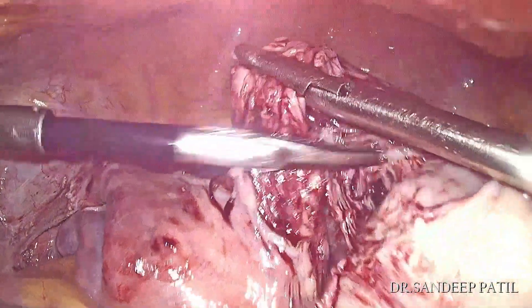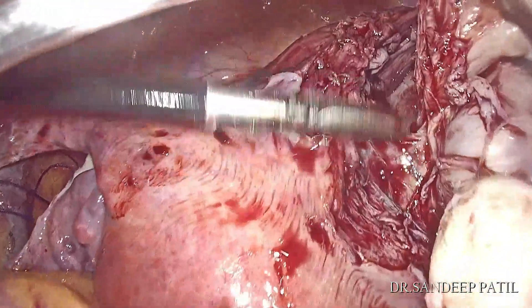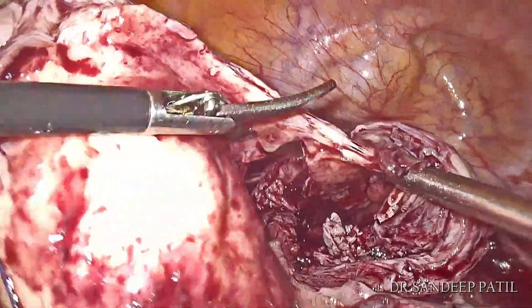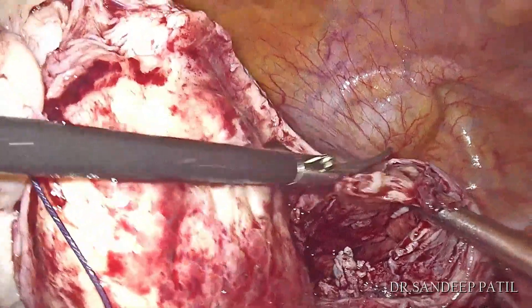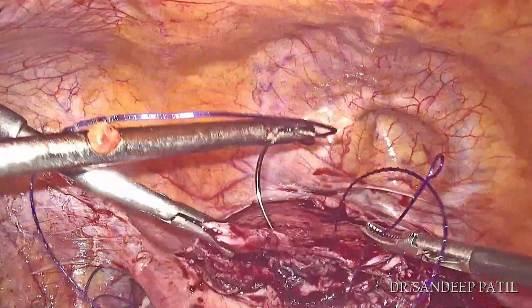One can notice exposure of the cervical canal at this stage. Once both fibroids are enucleated, the next step is suturing of the defect.